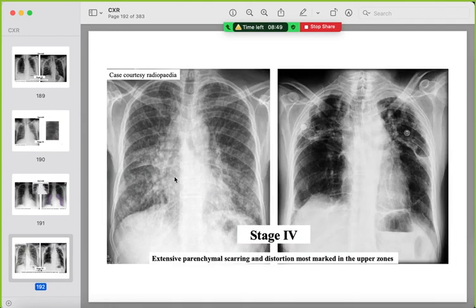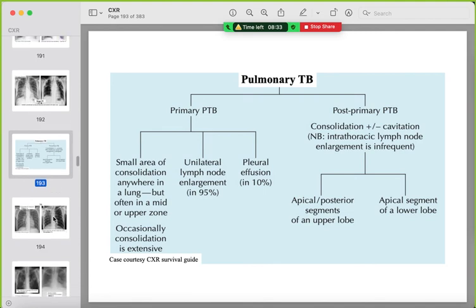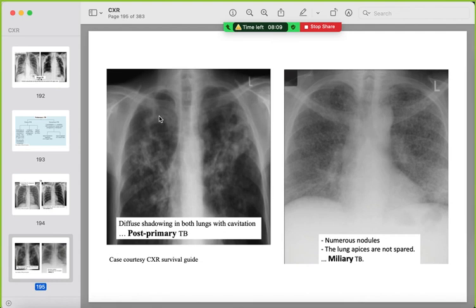Stage 4 sarcoidosis shows confluent fibrosis with architectural distortion and volume loss. TB has primary and post-primary signs. Primary TB shows hilar lymph nodes and clinical signs. Post-primary TB can show cavitation and lung fibrosis in the upper lobes. Miliary TB shows multiple innumerable small nodules — this is active disease and the patient should be isolated.